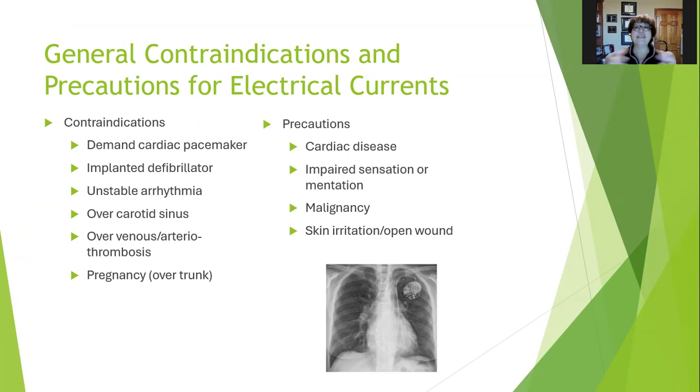Precautions, cardiac disease. So any kind of cardiac disease, because as we probably, hopefully recall from pathophysiology, a lot of the cardiac diagnoses kind of affect each other. And so if they have any kind of cardiac disease, it's a precaution. It's not an absolute contraindication, but you want to be cautious. Impaired sensation or mentation, that makes sense. Especially if you're doing a sensory application or even a motor application, you have impaired sensation, they're not going to be able to give you adequate feedback for you to get a good treatment.